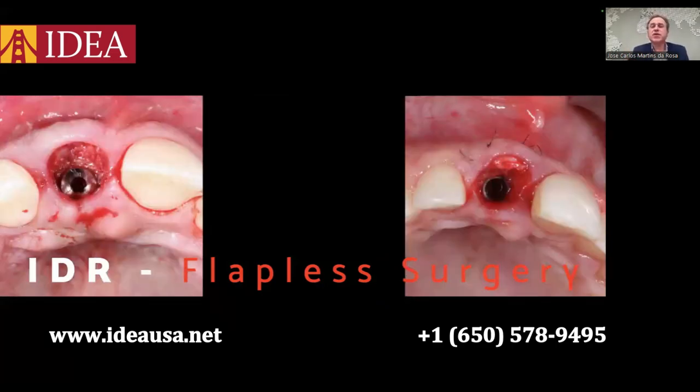And look at these two different cases. In this case, we only used a bone graft. And in this other one, we used bone and soft tissue graft.